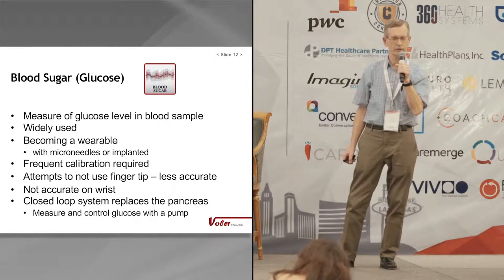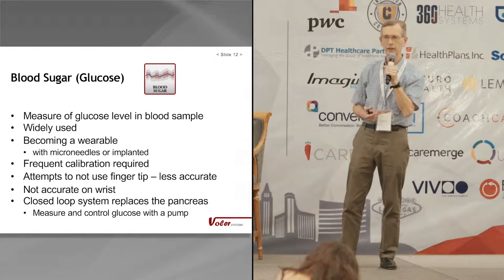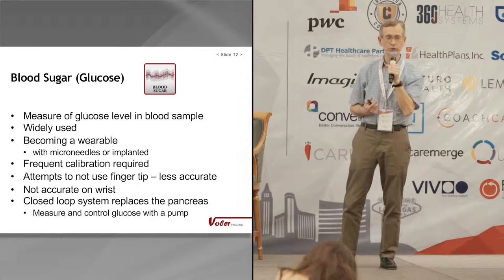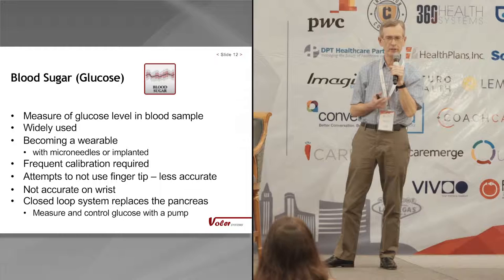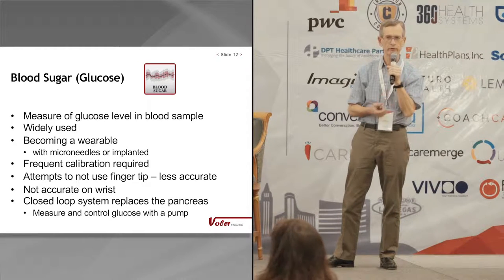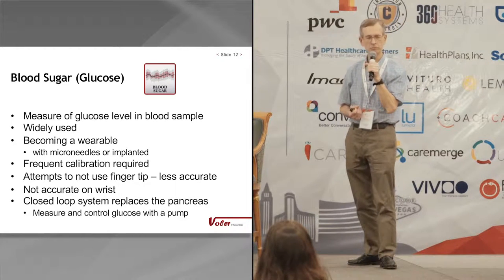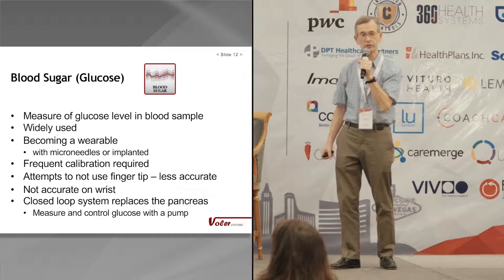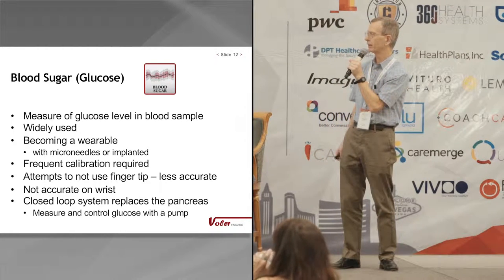Glucose is another thing that people have spent a lot of money trying to measure non-invasively. We now have patches which are technically invasive. They have microneedles on them. However, the microneedles are so small, they don't feel like needles. They don't hurt. So we've got something that's very successfully measuring glucose as a patch on the body.